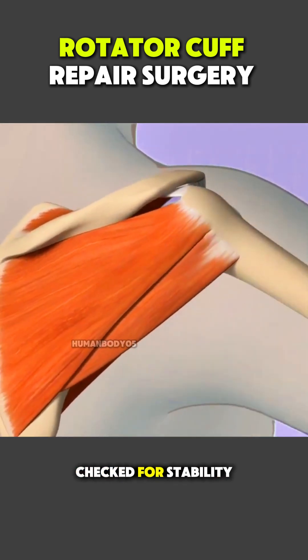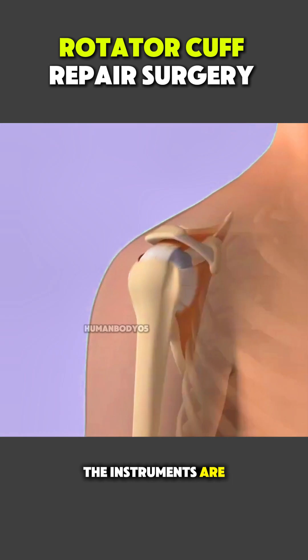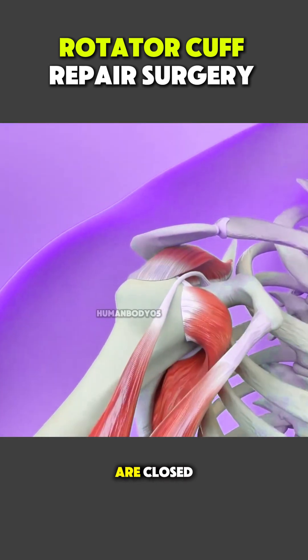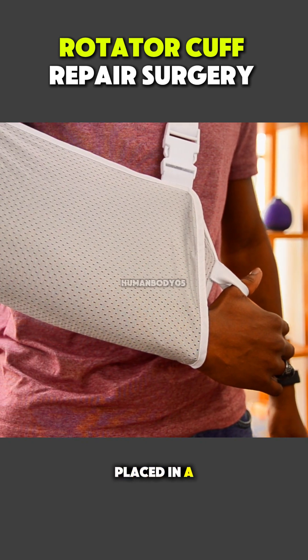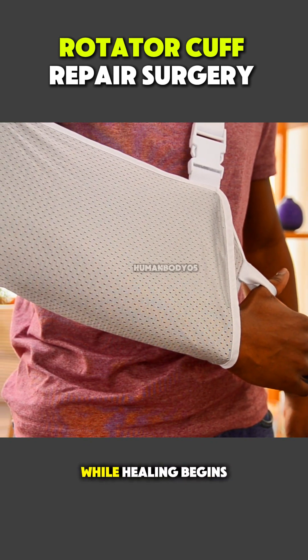the shoulder is checked for stability, the instruments are removed, and the incisions are closed. After surgery, the arm is placed in a sling to protect the repair while healing begins.